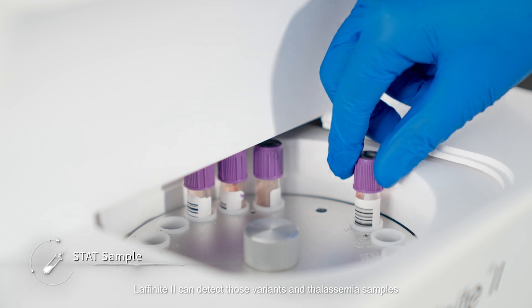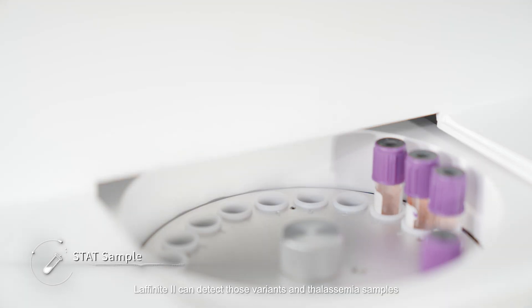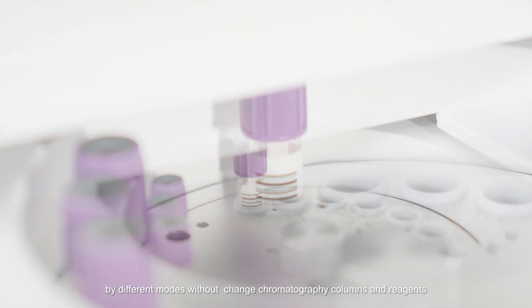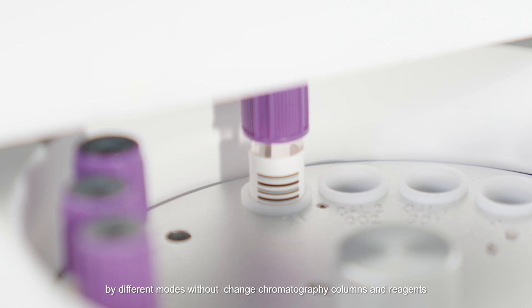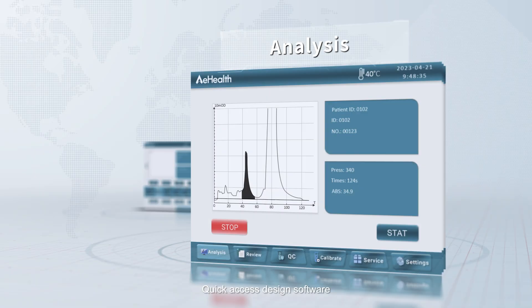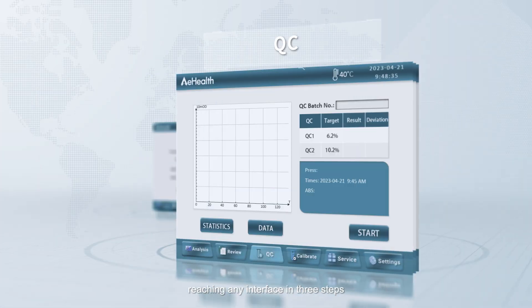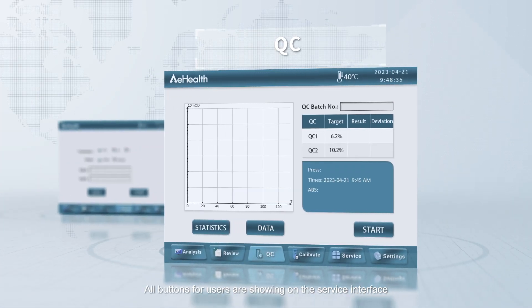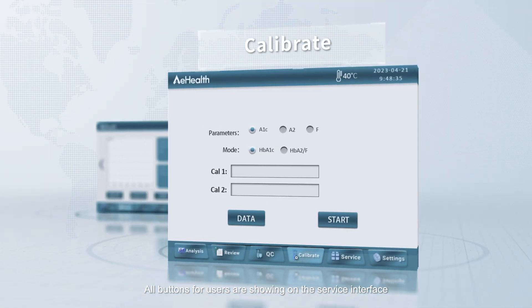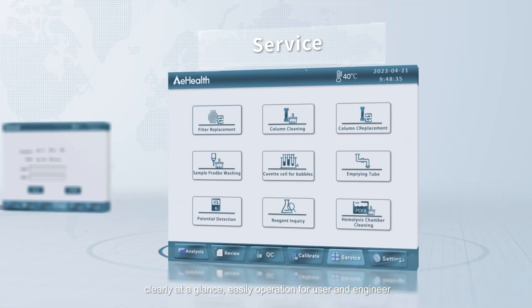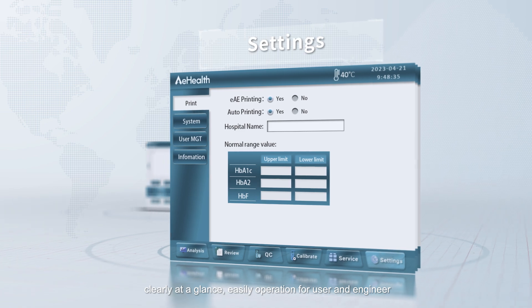Laffinite II can detect those variants and thalassemia samples by different modes without changing chromatography columns and reagents. The quick-access design software navigates any interface in three steps. All buttons for users are shown on the service interface clearly at a glance, enabling easy operation for both users and engineers.